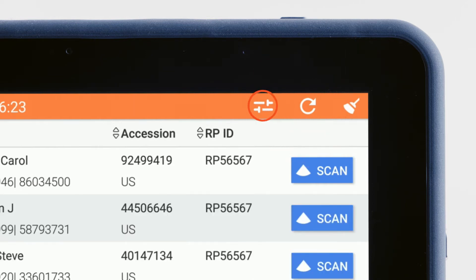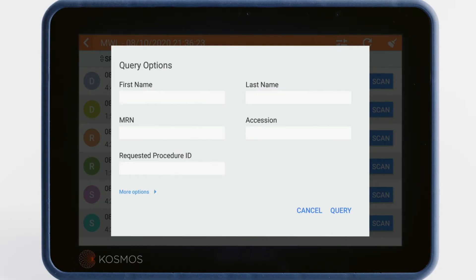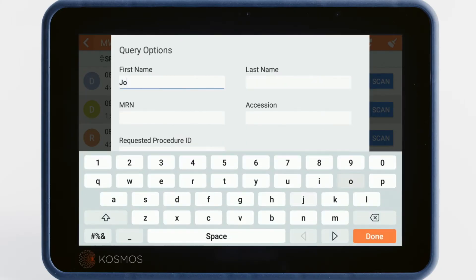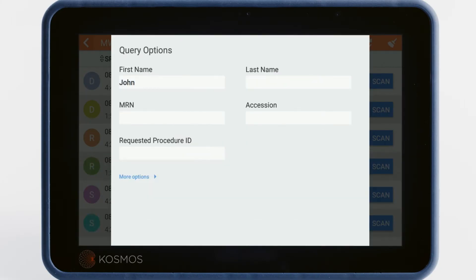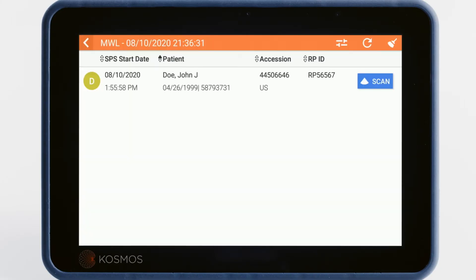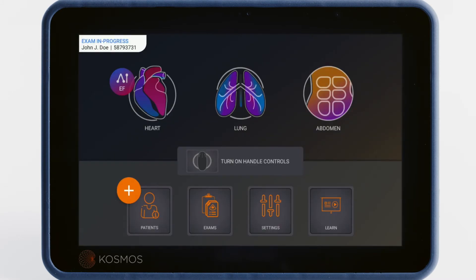Tap the Filter button to search for a specific patient. To learn how to connect your Cosmos Modality Worklist to your facility's Information Management System, watch video 10.